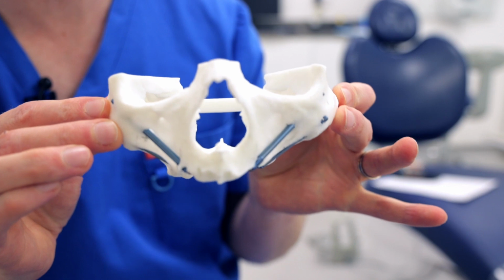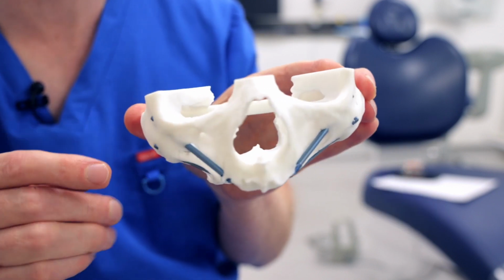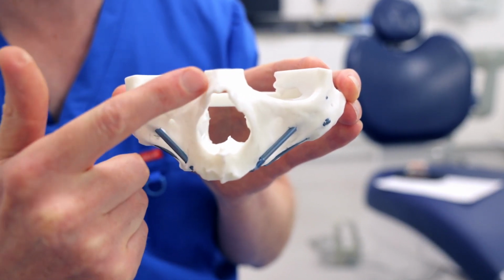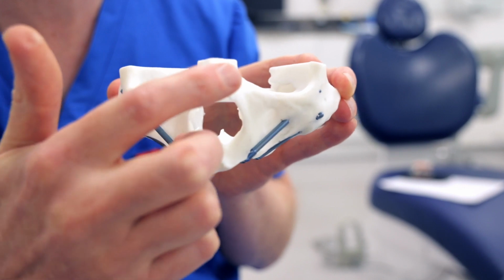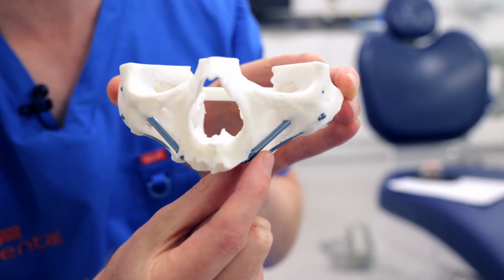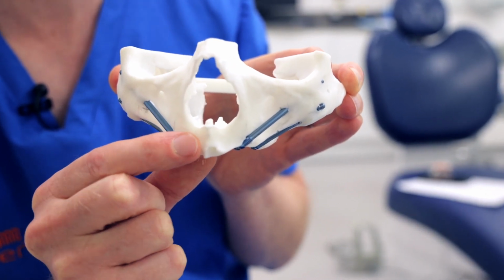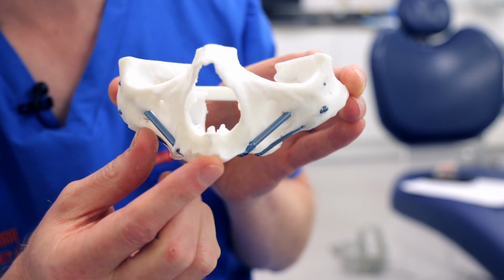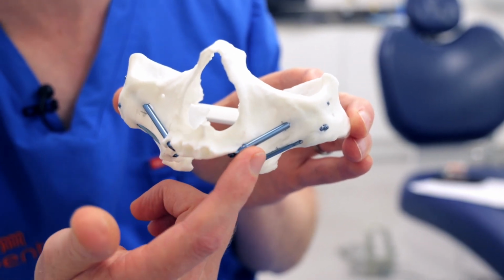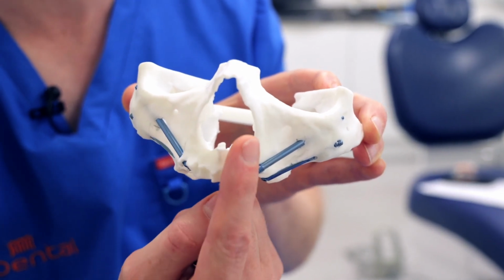So I'll show you this model. So this is a model of somebody's upper jaw, and I'll just orientate you because it can be a little bit confusing when you've not seen one of these before. So this is the nose here, and these are the end of the eye sockets, there and there. And then this here is the bone that supports teeth. Normally, this is the bone where you would find teeth. And in situations where we provide full mouth implant solutions for people, this is exactly where we're putting implants, just into this bone. But generally the implants are placed vertically, up like this.